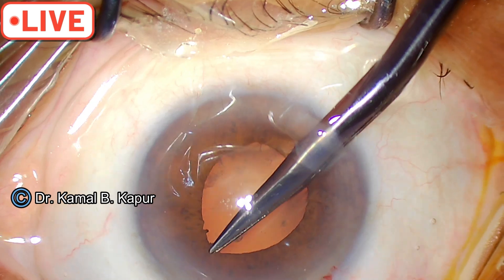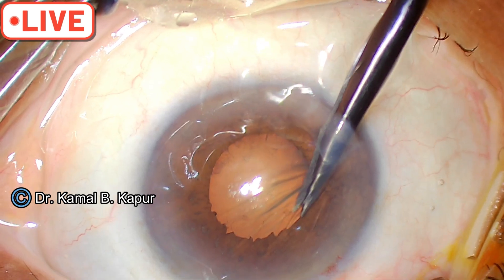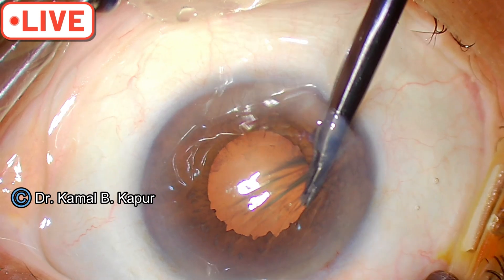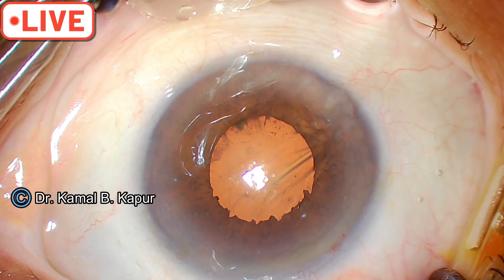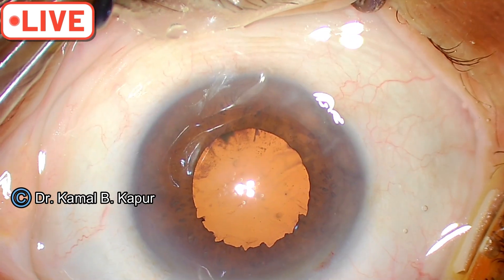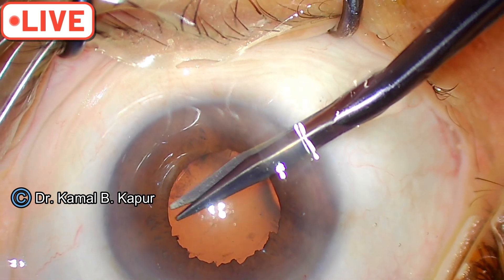These are small micro-sphincterotomies and you will be amazed that tomorrow morning they will look nearly normal. Once the pupil closes they will fix onto themselves and behave normally. Keep instilling viscoelastic. You have to make sure you don't accidentally cut the capsule when you do this — it needs a little bit of practice but it works very well.